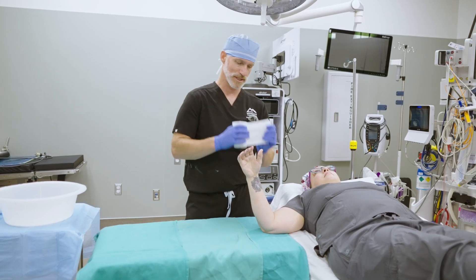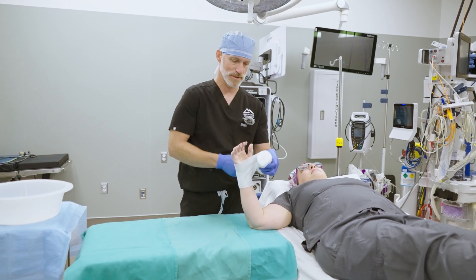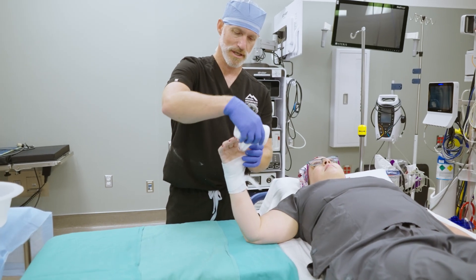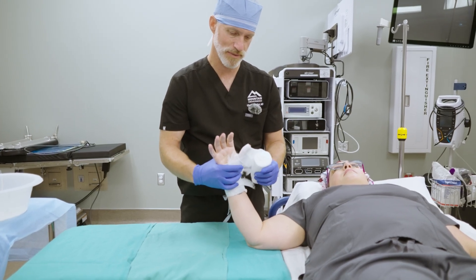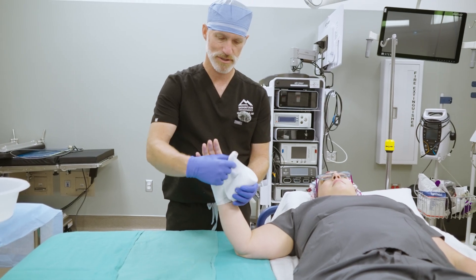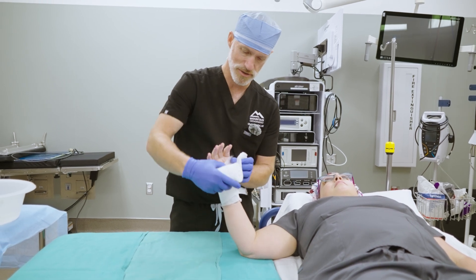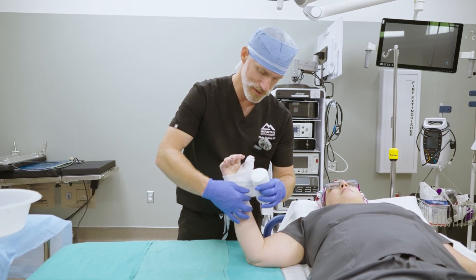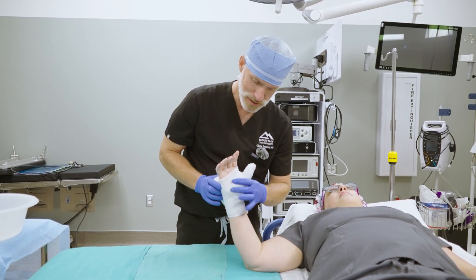The way I like to do this splint is start on the wrist with the cast padding, then come up to the thumb and make small tears in the cast padding to allow it to fit around the thumb. I'm going to take about two to three loops around the thumb, keeping the IP joint free. Then I'm going to do two to three loops around the palm.